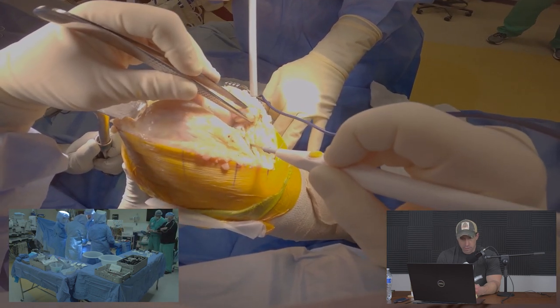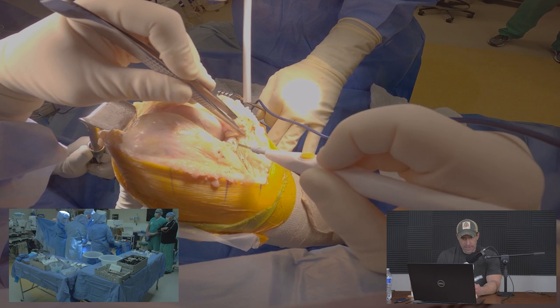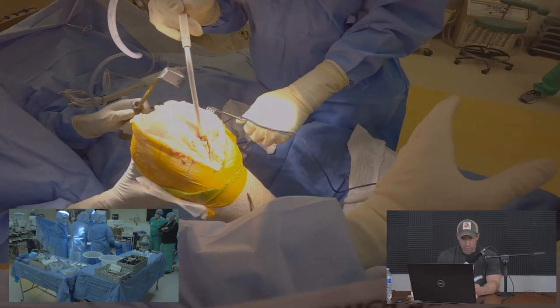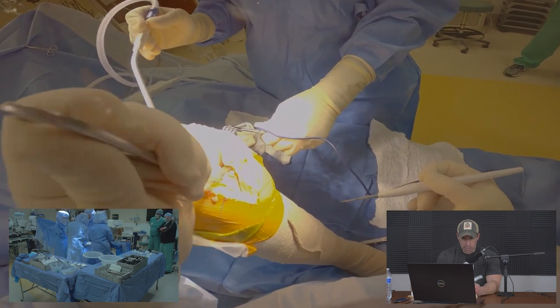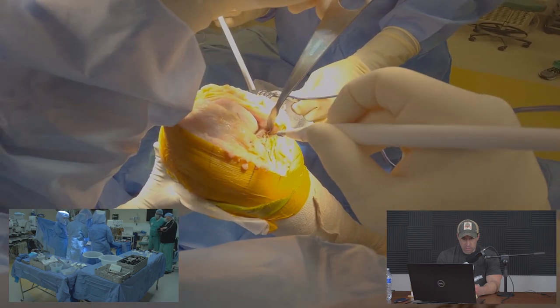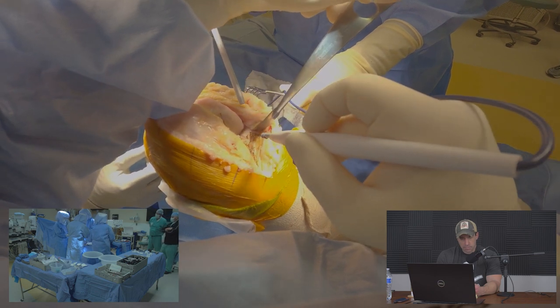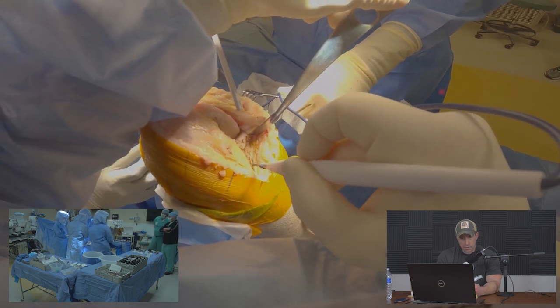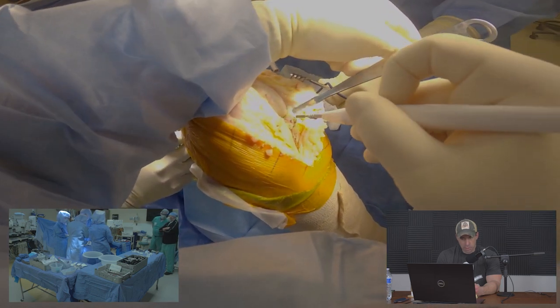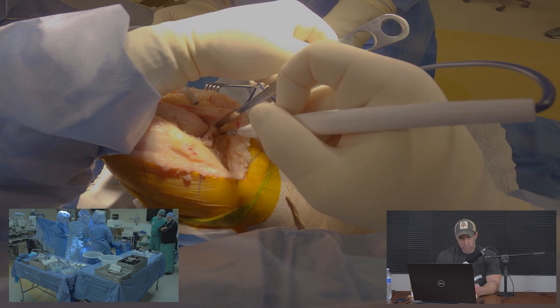The medial soft tissue sleeve is elevated in one flap to allow us to place retractors. A retractor is placed to protect the medial collateral ligament. You can already see large bone spurs and wearing away of the cartilage on the medial side of the knee, which is why we're doing the replacement.